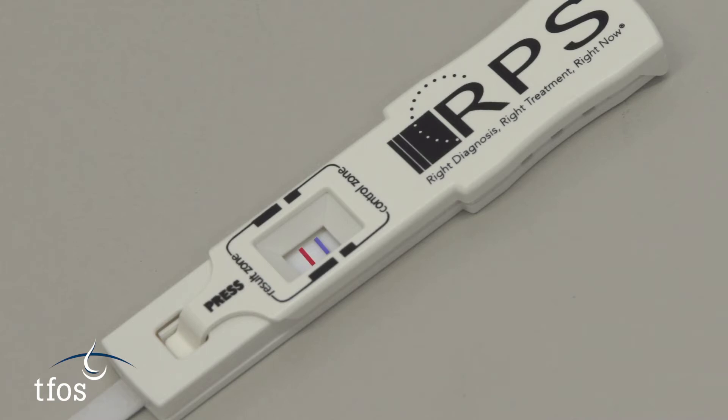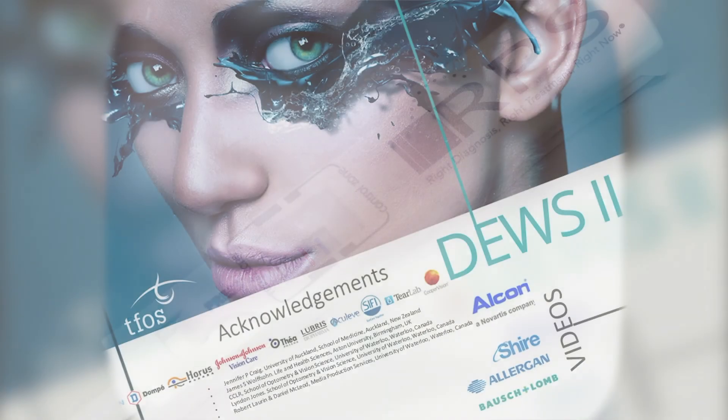If a second red line is also present, this equates to a positive result, which indicates the presence of marked inflammation.